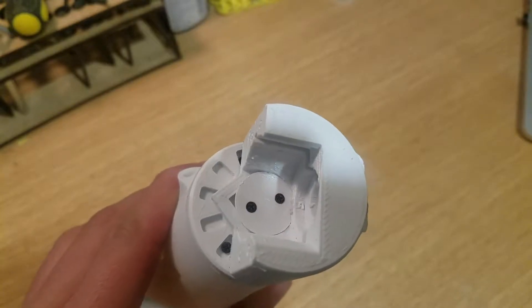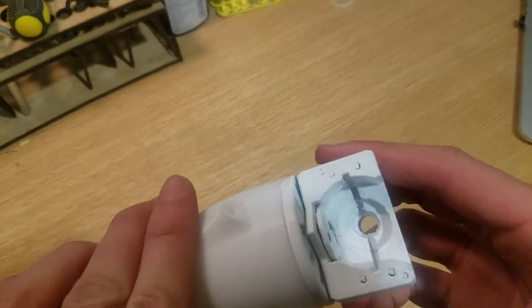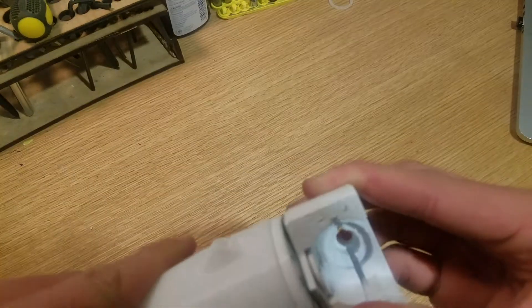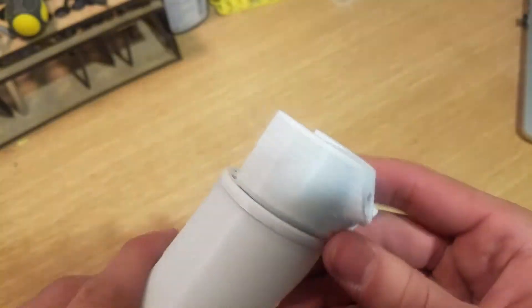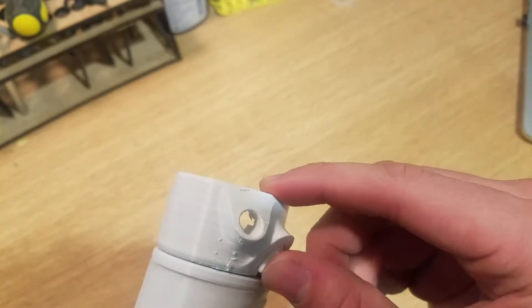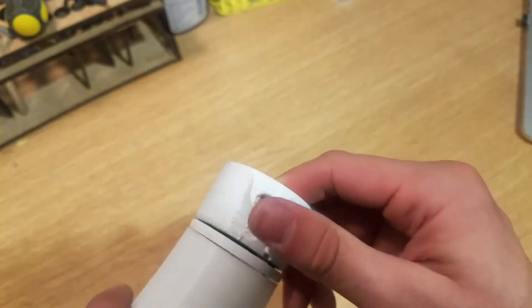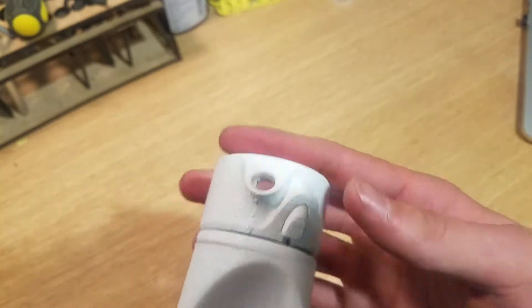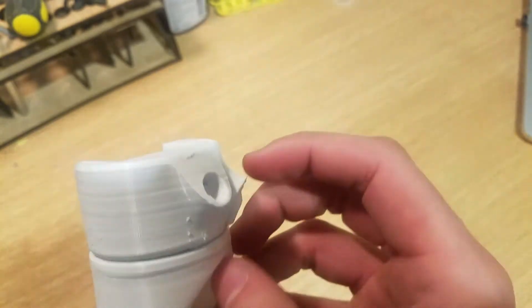After a few minutes of finagling, I was able to get it on. As you can see, that just provides a little bit of rotation, and we have our ball bearings in there along with this piece right here. The goal is that when you push up on this piece it allows you to rotate, and then it comes back down — I'll just have to work on the fluidity of pushing this one up and down.